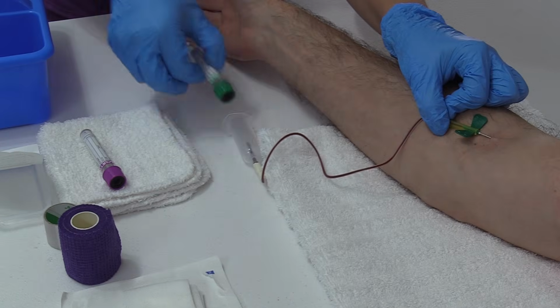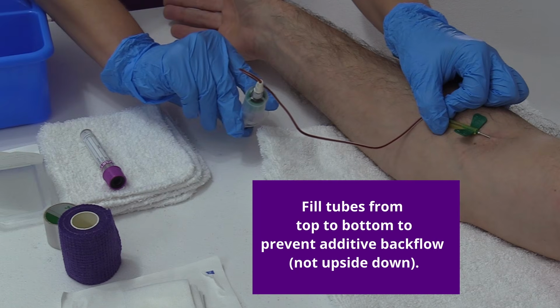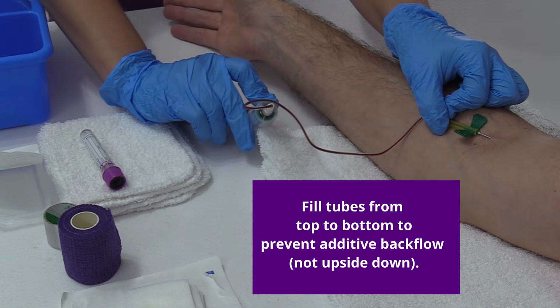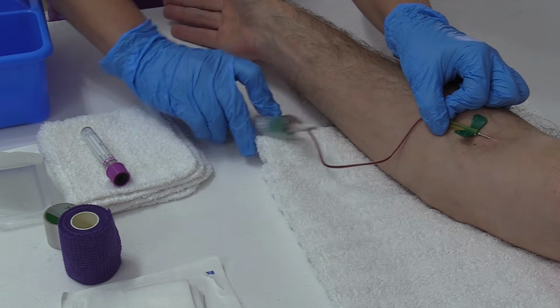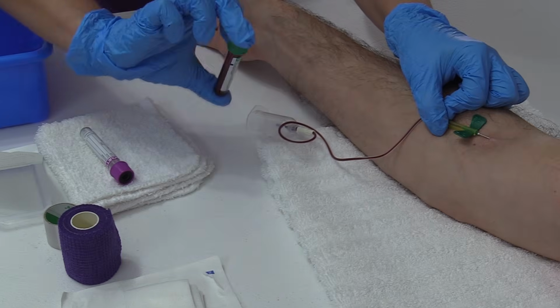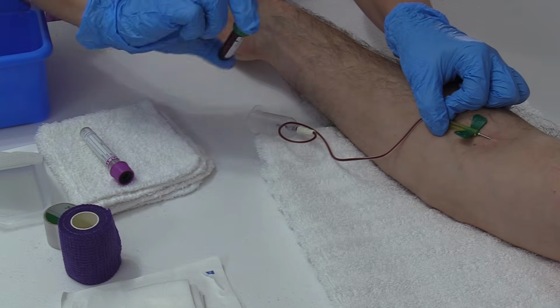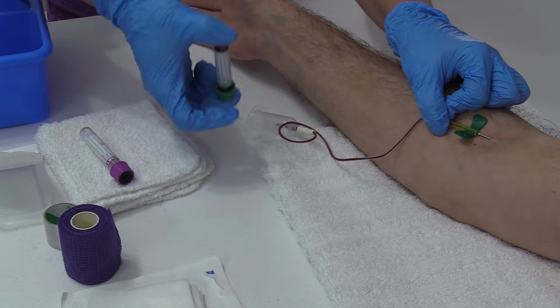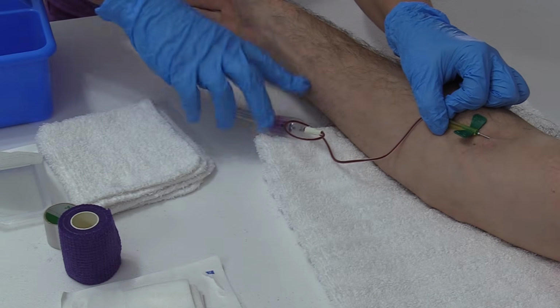Now I'm going to do my green. And making sure letting these tubes fill from top to bottom. Again, looking at my fill line. Okay, that is full. Now I'm going to invert that about 8 to 10 times. So 1, 2, 3, 4, 5, 6, 7, 8. Set that aside. Then I'm going to pop on my last tube.